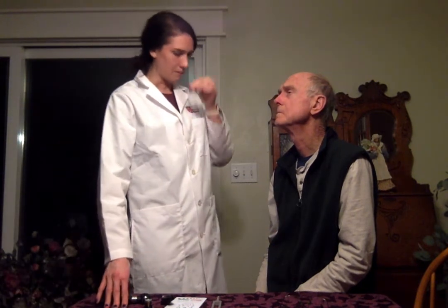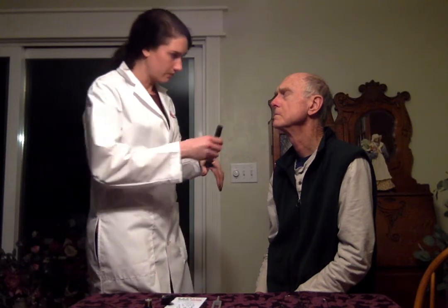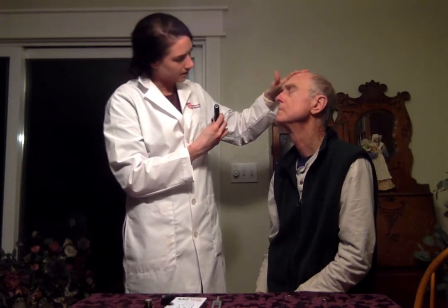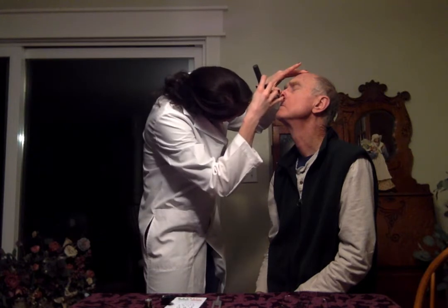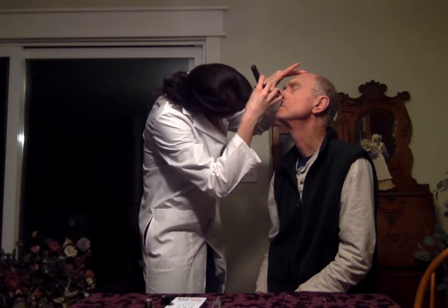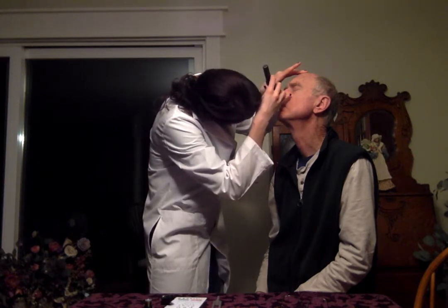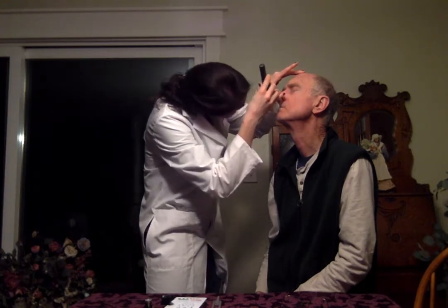I'm going to go ahead and look inside of his nose. So I'm going to be assessing the mucosa to see what color it is. I'm also going to be assessing the turbinates to see if they are in view. And so I'll go ahead and assess. I'm going to have him put his head back and then this up right here. So I'm looking inside of his nose. His mucosa is pink. The turbinates are shown. There's no discharge, there's no drainage, no signs of infection.